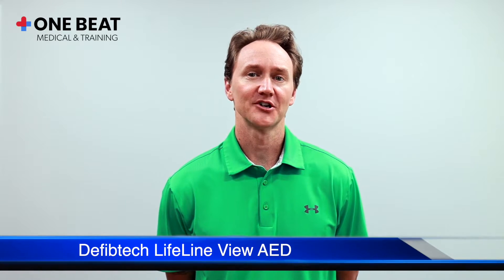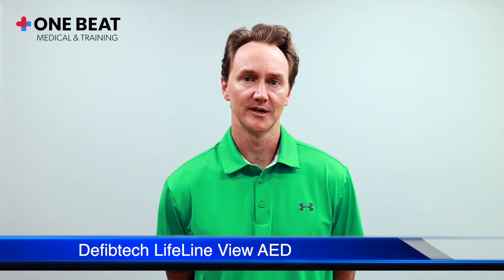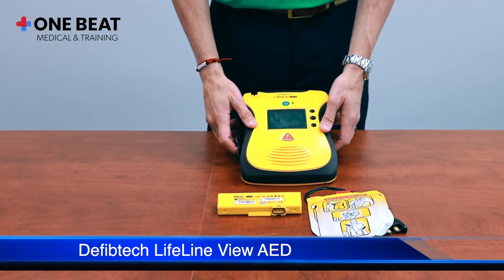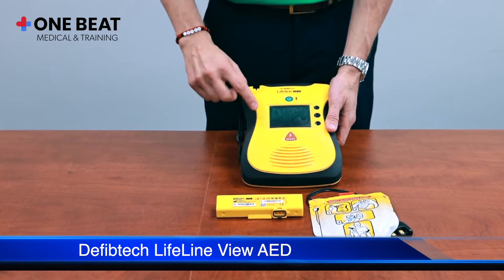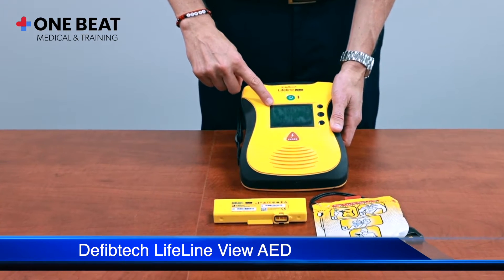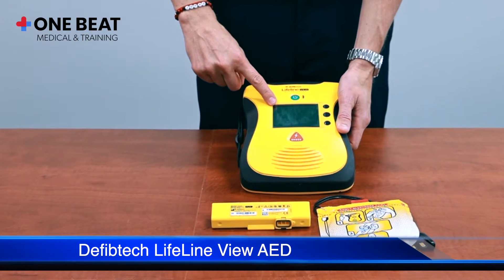Hello. We're going to talk about the features and functionality of the DefibTech Lifeline View AED. The first thing you'll probably notice is that there is a screen on the AED. This screen will have color images that walk the rescuer through the use of the device.